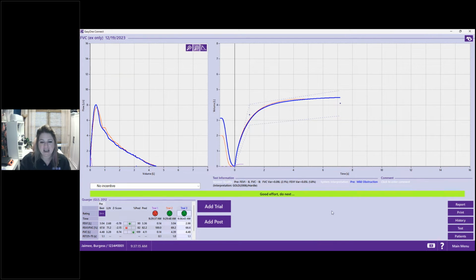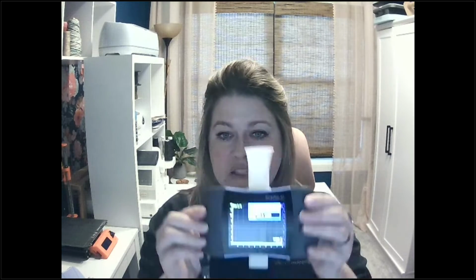All right, I am going to go ahead and stop sharing that one more time, and I'm actually going to finish the trial here on the Air device. So I'm adding another trial here on the device. All right, it's giving me the prompt to blast out.